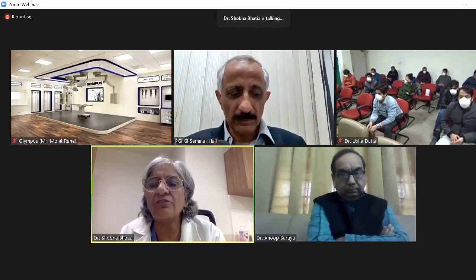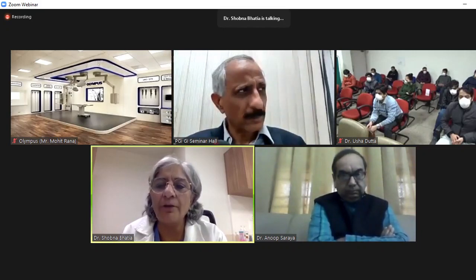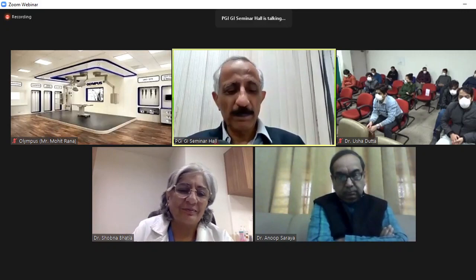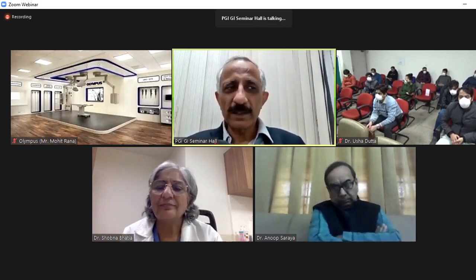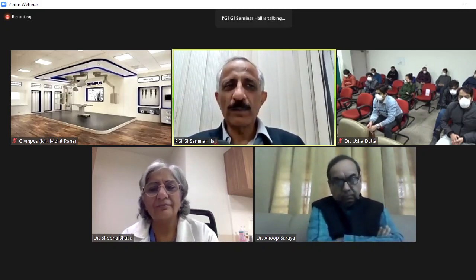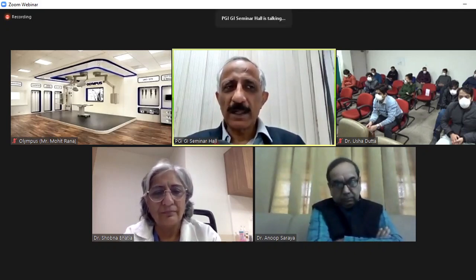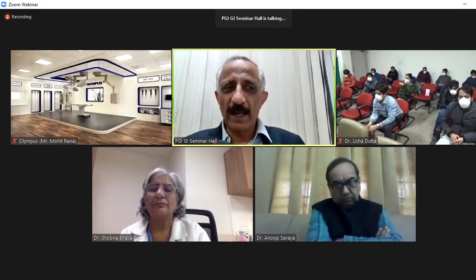Okay, there's one question from Preeti Gupta. When can we say that there is a deformed duodenal bulb? Oh, yes. I had thought that I'll add a couple of pictures. See, once you reach the pylorus, you inflate air. Ideally, you must give Buscopan, a muscle relaxant. The duodenal bulb is classically bulb shaped and should be smooth, distending well.